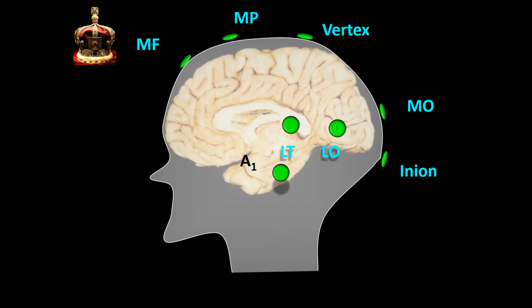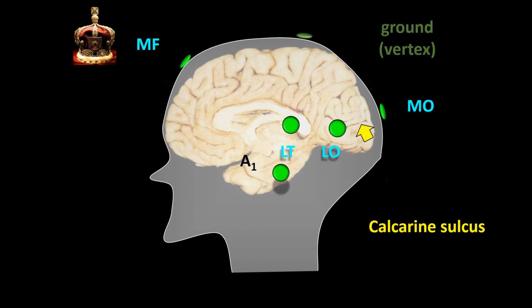In this new frame, I have changed the view of the brain. Instead of showing you the lateral hemisphere, I am showing you the mid-sagittal view of the brain. I have done so to show you the position of the calcarine fissure. Advocates of the Queen Square system argue that the placement of these electrodes in this location is better suited to monitor the calcarine sulcus than using the 10-20 system, and the Academy seems to agree with that assessment.